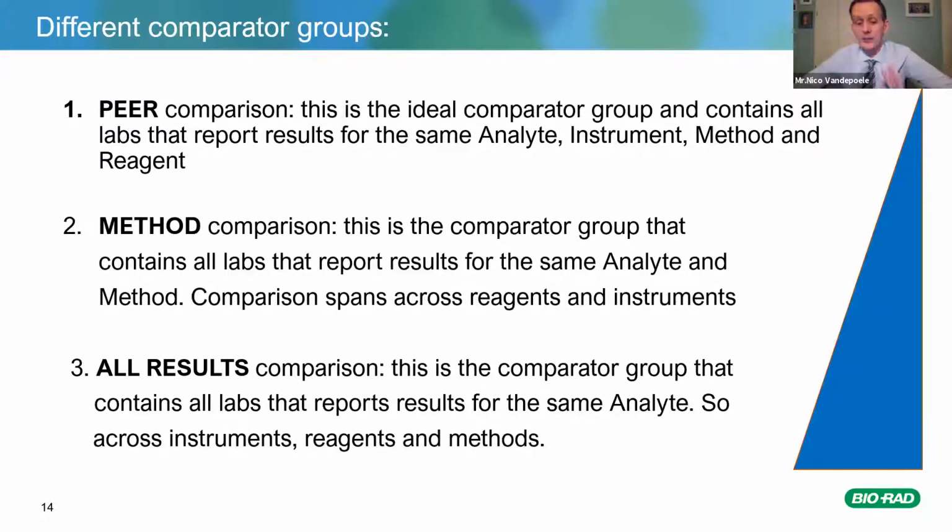It is also always very important, when you look at an evaluation of an interlab comparison, to look at the imprecision of that group. If you see that the group imprecision is very, very wide, you might understand that it's very easy to pass and to be compared to it and have a good result. But make sure that you understand what the value is of that group, because sometimes these groups might be so wide that there's actually almost no comparison anymore.